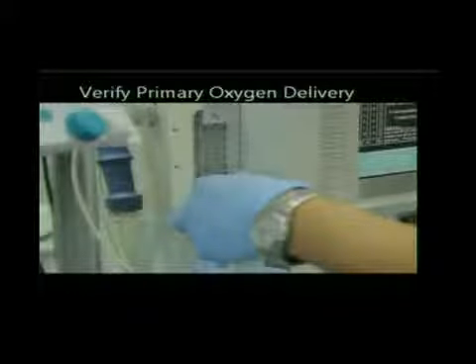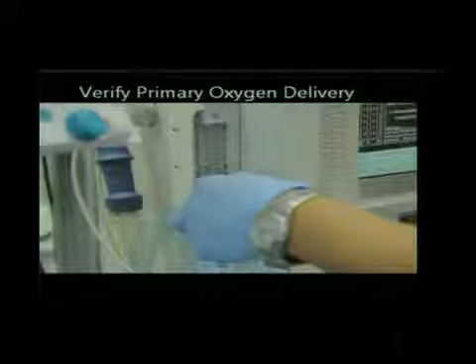So this is placed, and he's just verifying that he has the unit here and that it appears ready to go. So I mentioned everything is organized. That may sound silly, but it's actually really important because when there are problems, you have to respond in anesthesia in a matter of seconds. You have to know where things are. It has to be set up.